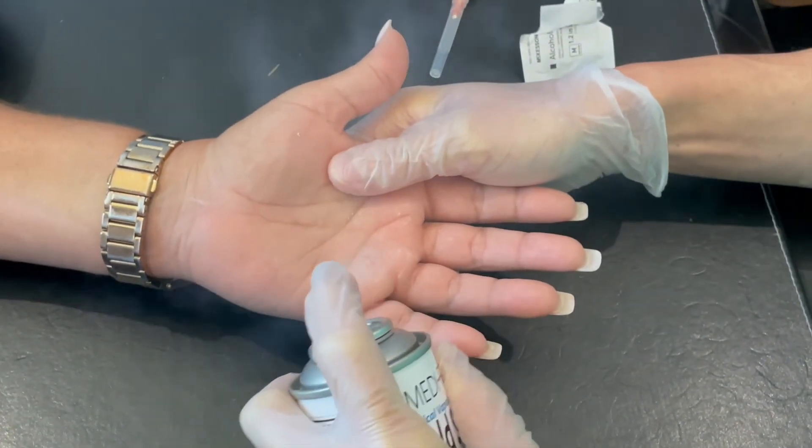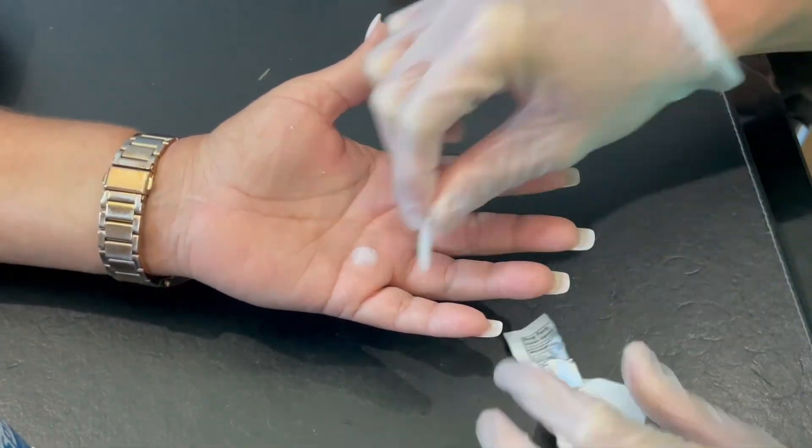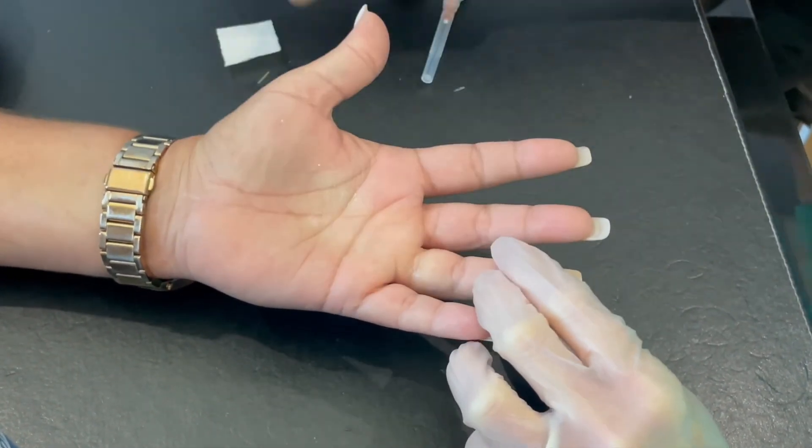So here's the injection. We use a butane cold spray to provide a little anesthesia and then an alcohol swab to clean the skin.